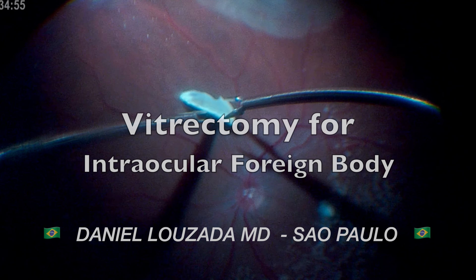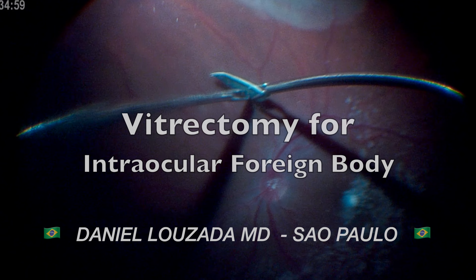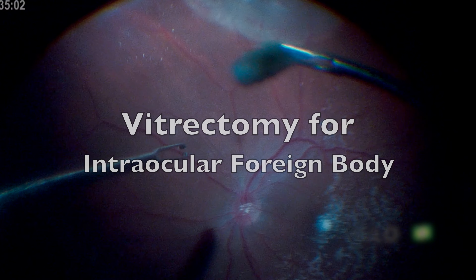In this video, shared by Dr. Daniel Lozada from Sao Paulo, Brazil, we will discuss the surgical management of a case of ocular trauma with intraocular foreign body.